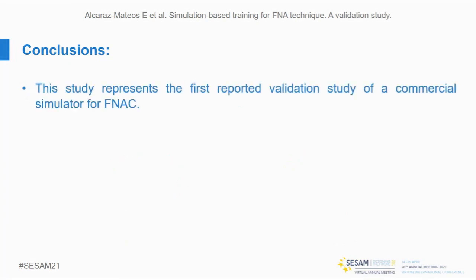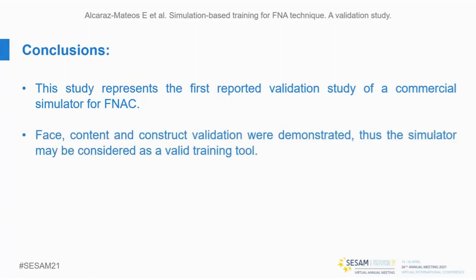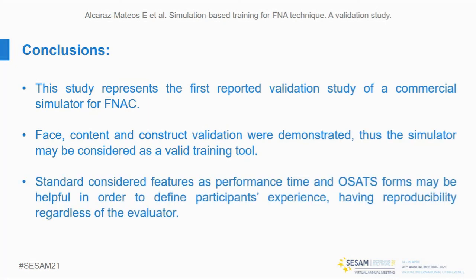Conclusions. This study represents the first reported validation study of a commercial simulator for FNAC. Face, content, and construct validation were demonstrated. Thus, the simulator may be considered as a valid training tool. And standard considered features as performance time and OSAT forms may be helpful in order to define participant experience, having reproducibility regardless of the evaluator.